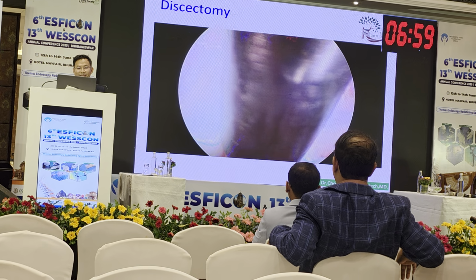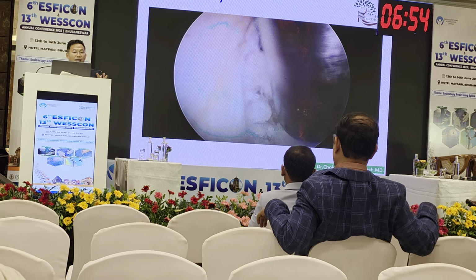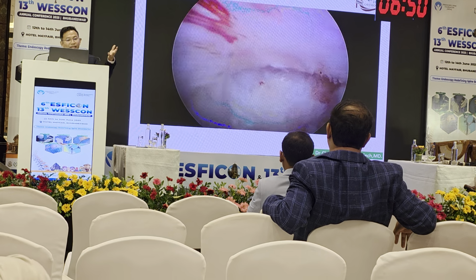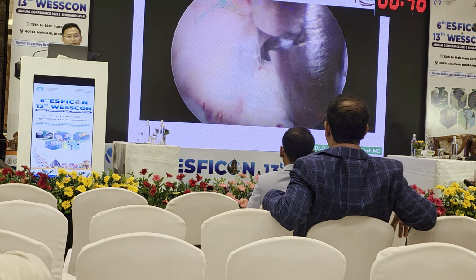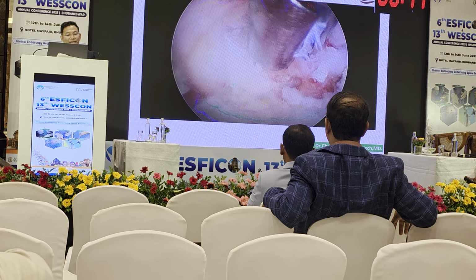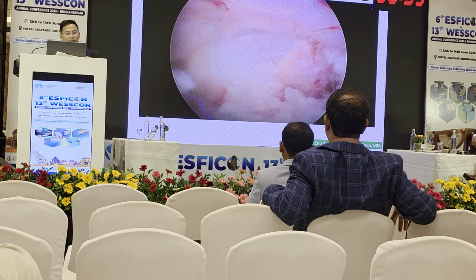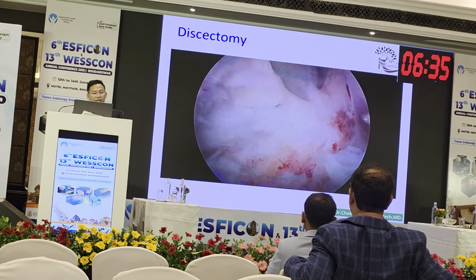After I decompress both sides, I mean the contralateral too, I try to do the discectomy. For this case the disc was calcified. That is a problem. You have to break the calcification and try to remove the disc.